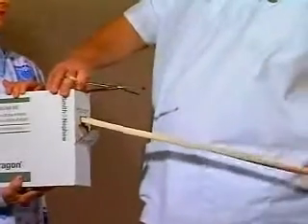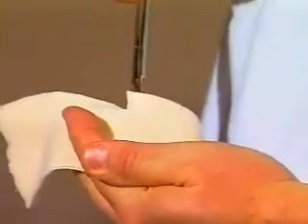Cut an appropriate length of stockingette. If required, cut a one centimeter slit along the edge for the thumb. Roll the stockingette in order to apply more easily by unrolling onto a limb. Remove the wrinkles.